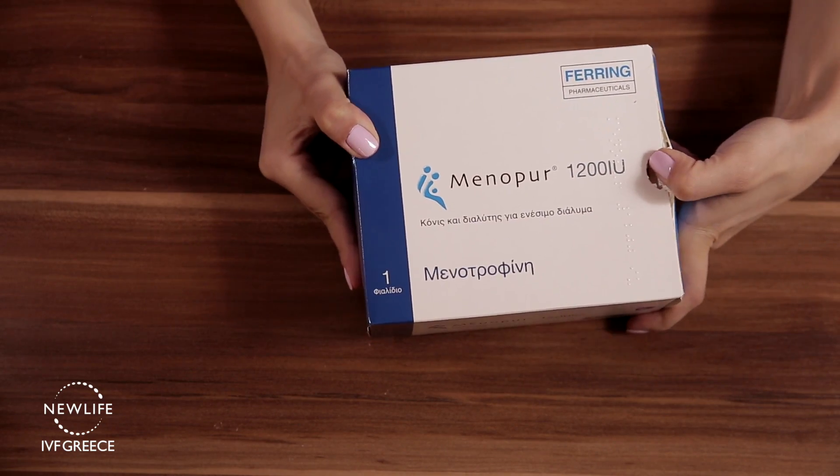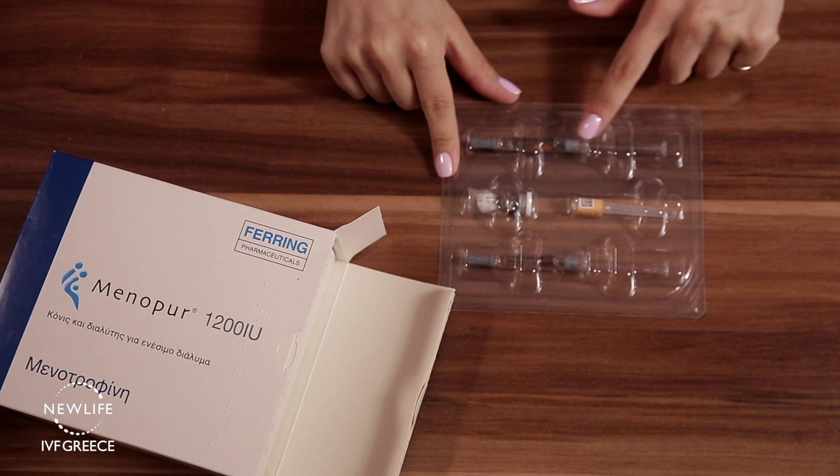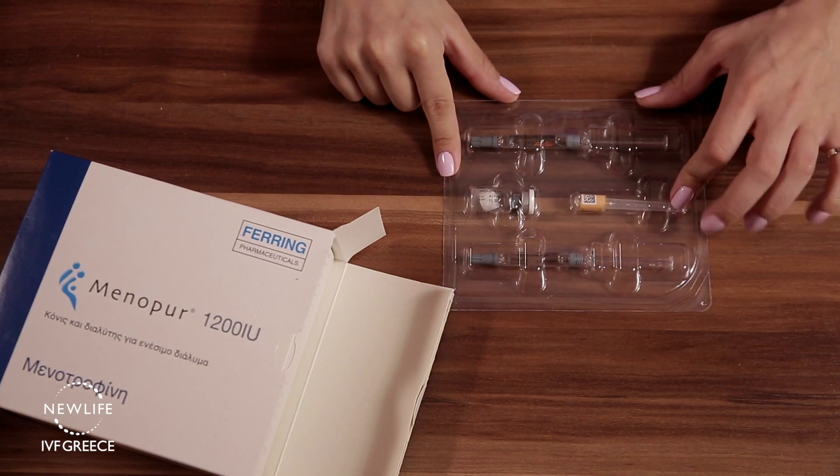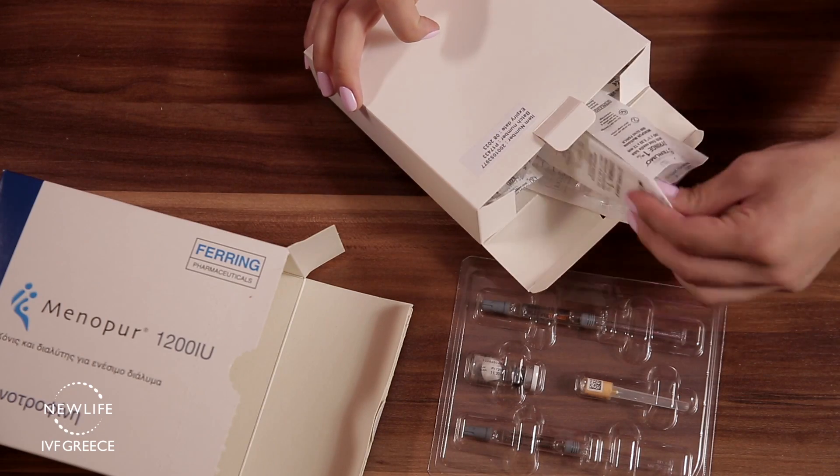Inside the packaging you will find two pre-filled syringes with solvent for mixing, one powder vial, one needle for mixing, and many disposal syringes for administration.